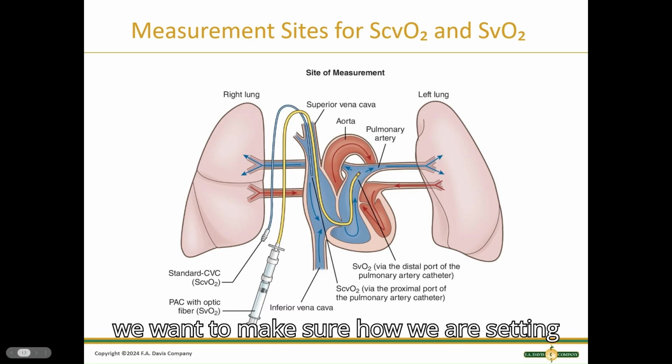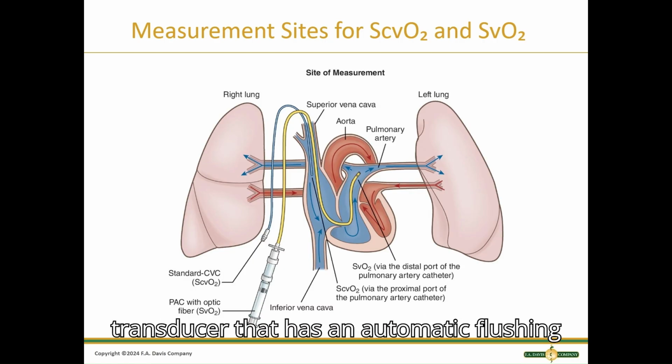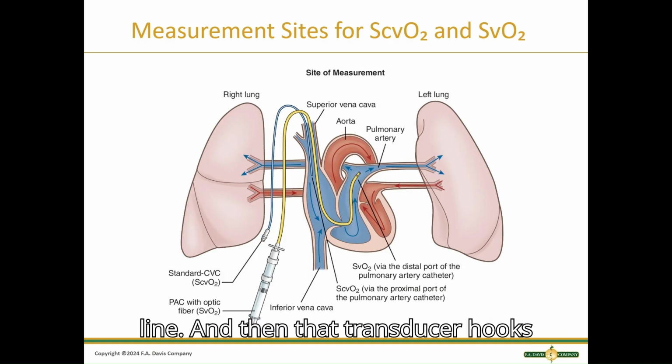This is just another picture showing how that catheter is floated through and at different sites where we would be measuring oxygen saturation.